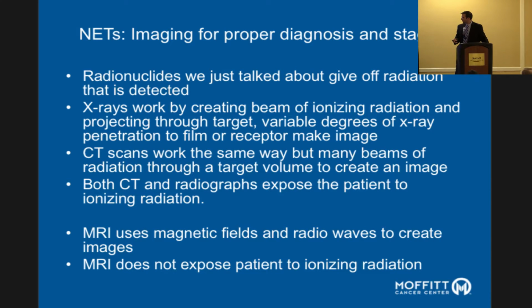Whereas an MRI uses magnetic fields and radio waves to make images, so that doesn't expose you to any kind of ionizing radiation. And when I say ionizing radiation, what that means is that there's a potential that it could damage your DNA.